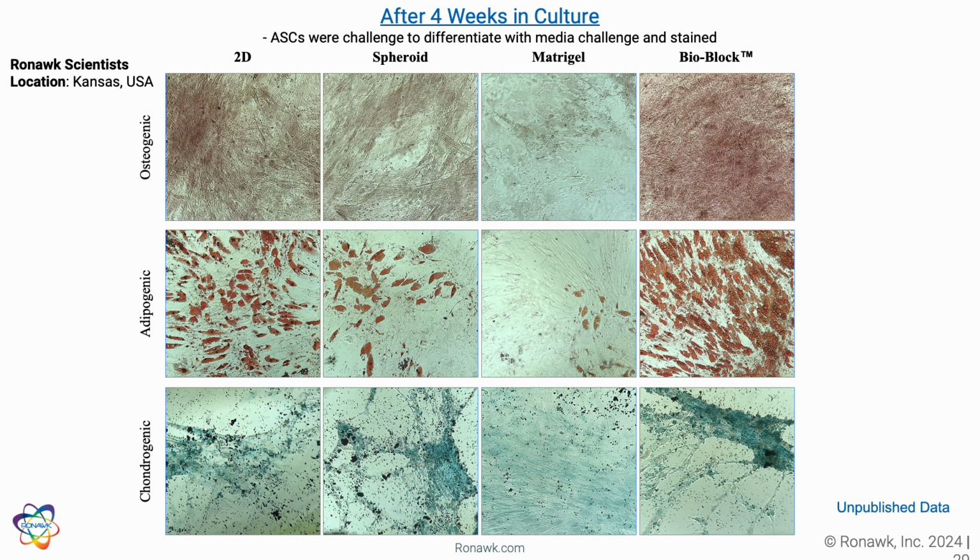We are delaying that senescence, and we're keeping the potential of those cells to actually do what we wanted them to do, in this case of the MSCs, to differentiate into the specific lineages. But if you're working with iPSCs, we will keep retaining their ability to differentiate also.